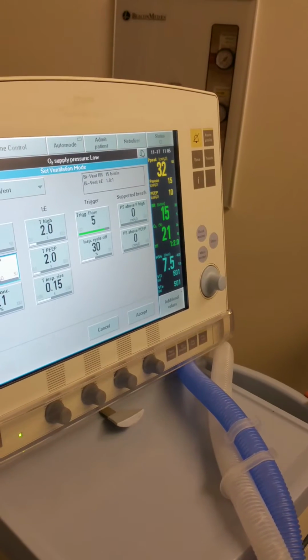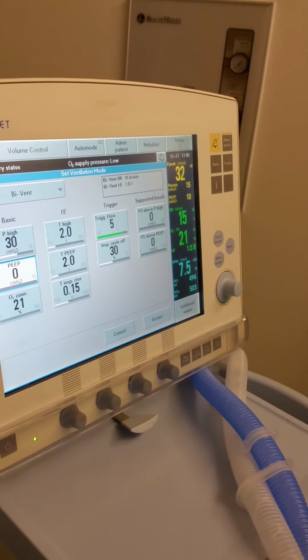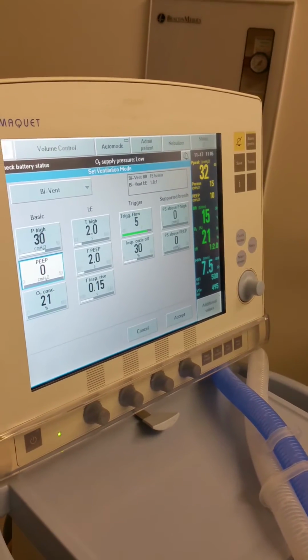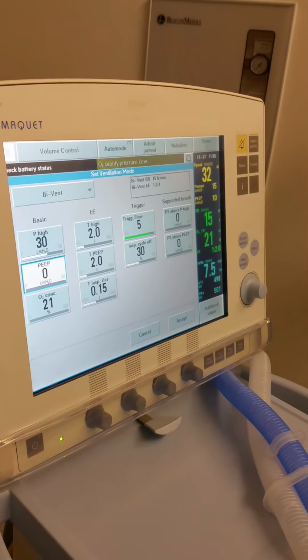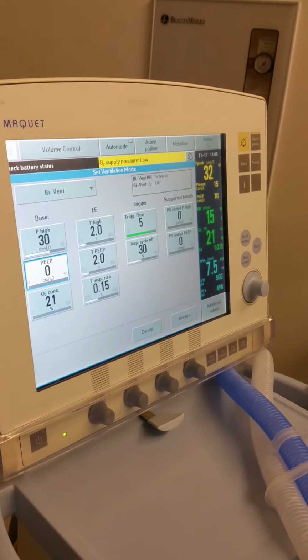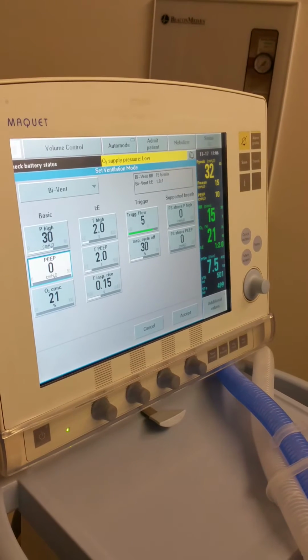The PaO2 is only 50, so being at 15 might not be enough. It all depends on what their compliance is. Again, it's just a place to start. But just be aware that you really want to have appropriate tidal volumes because that's going to become very important in this mode. So then your T high, where do you want to start the T high?